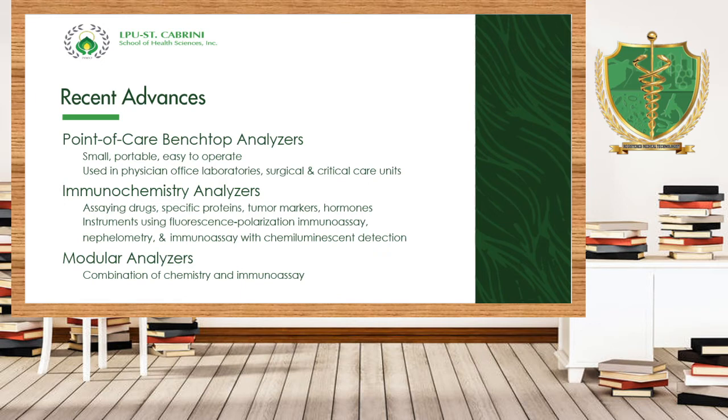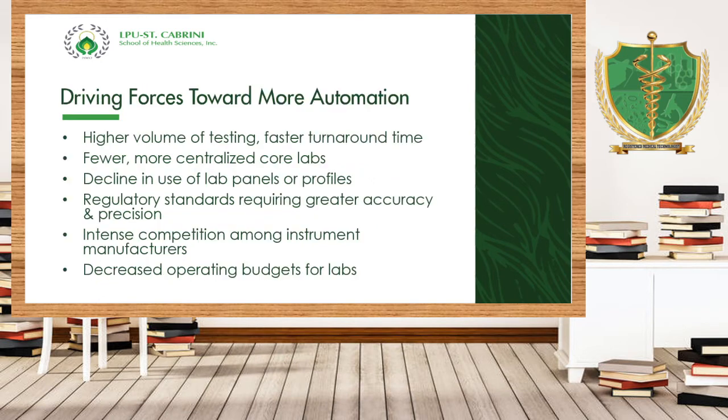We also have what we call the immunohistochemistry or immunochemistry analyzers. I'm sorry, which is capable of assaying drugs, specific proteins, tumor markers, and hormones. So I will not go deeper on that because we have discussed that already in our synchronous session. So I will start our discussion with driving forces towards automation.